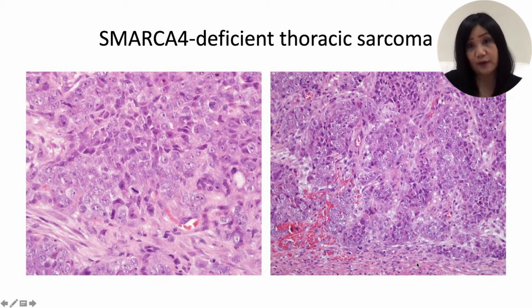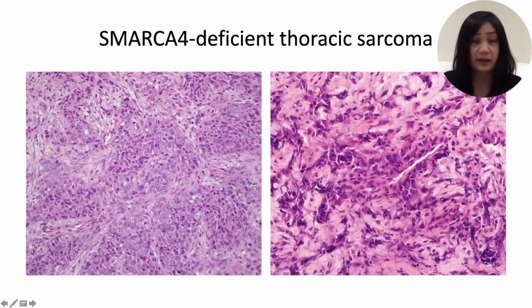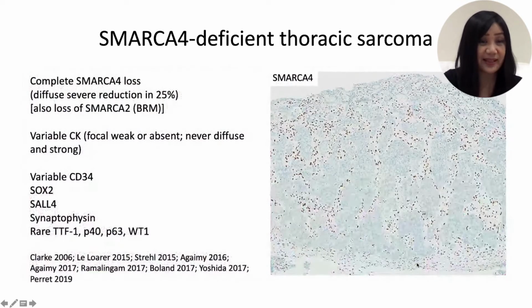So this is a variety of morphologies. We can just see high-grade, large cells with an epithelioid undifferentiated morphology associated with mitotic activity, present as sheets, cords, nests, or trabeculae, so the architecture can vary, but we can also see that there is no evidence of any epithelial differentiation. No lumen formation, no keratinization, no intercellular bridging, completely undifferentiated tumours.